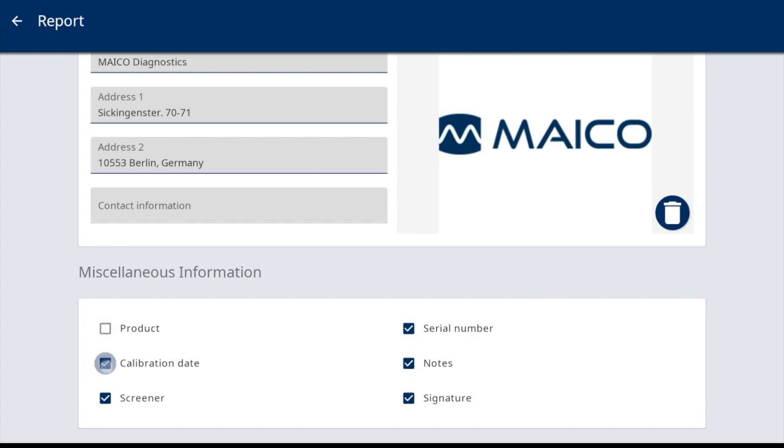Options include the product name, calibration date of the audiometer, screener name when activated and selected within the start screen, serial number of the device, notes where entered notes in the review screen will be printed, and signature, which includes a signature line for manually signing the form.